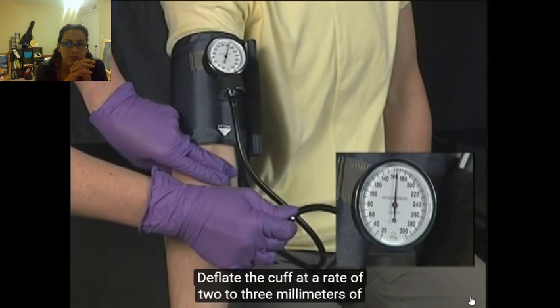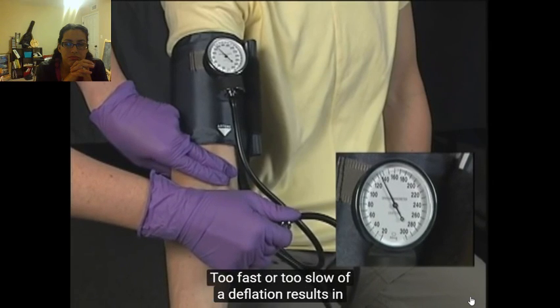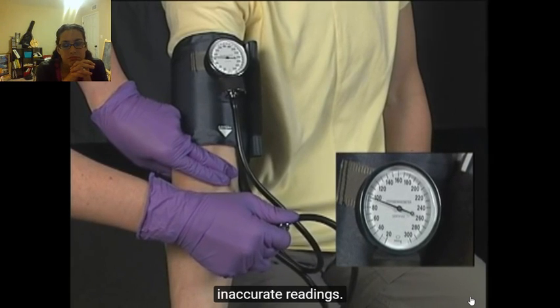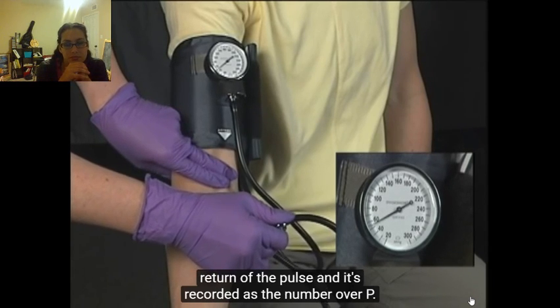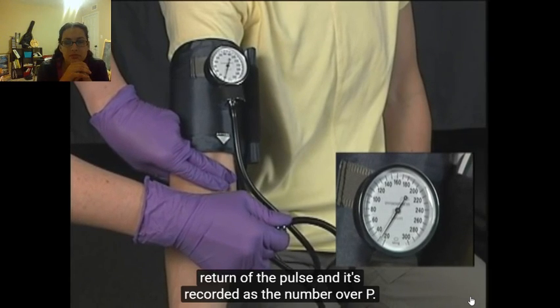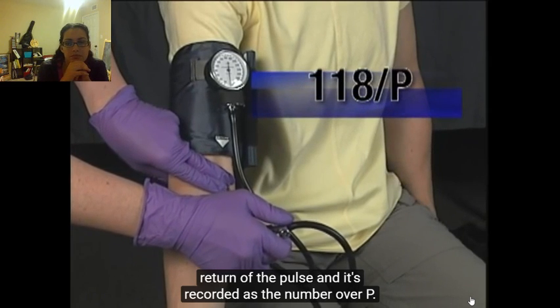Deflate the cuff at a rate of 2 to 3 millimeters of mercury per second. Too fast or too slow of a deflation results in inaccurate readings. The systolic pressure is recorded when you feel the return of the pulse, and it's recorded as the number over P.